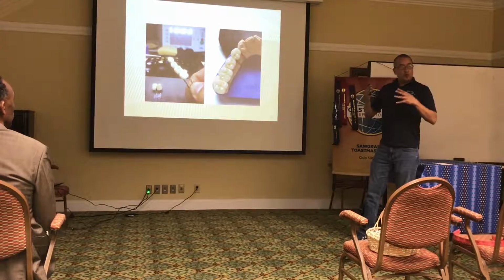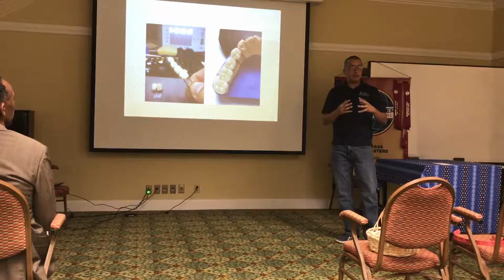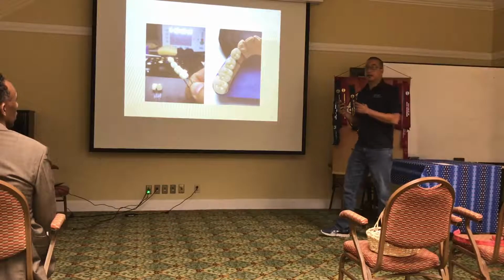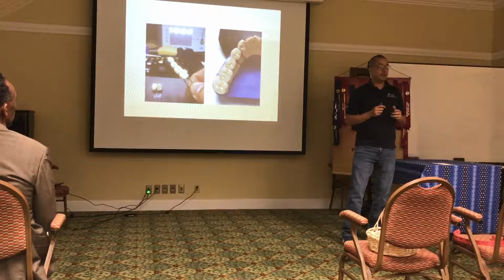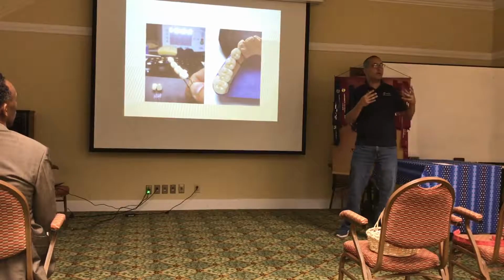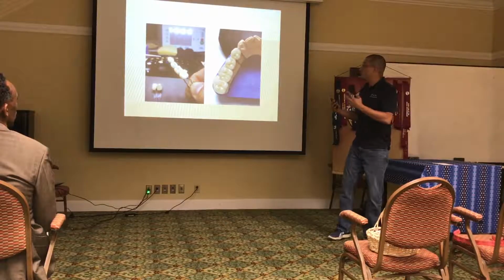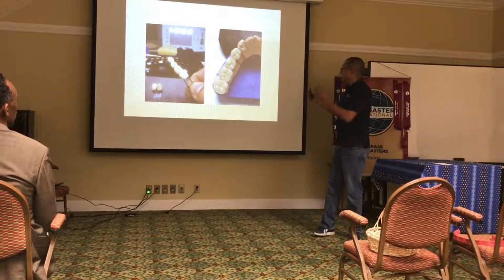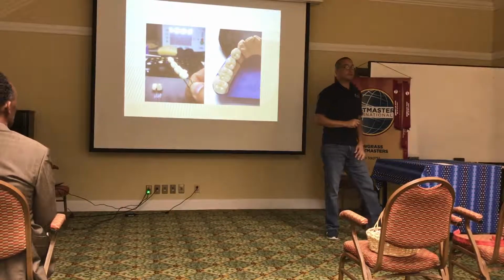Now when you got everything ready, and it's ready the way that you want it, all the anatomy, all the shape, all the bite, the contact, you proceed to go ahead and glaze it. The glaze is a little paint. That's when the art comes. You start painting to make it more natural, to give them a little bit more life. Put some blue, some yellow, some orange, some colors in there, and then you glaze it. Once it bakes, it comes out. Like that.